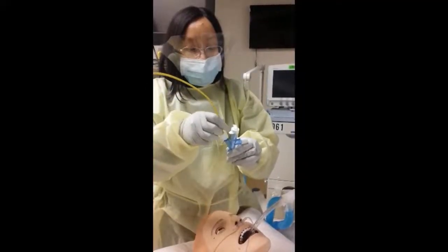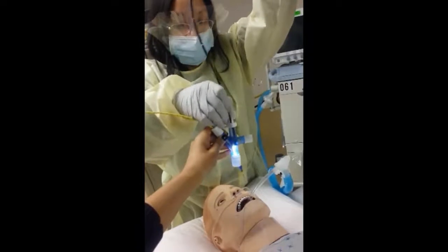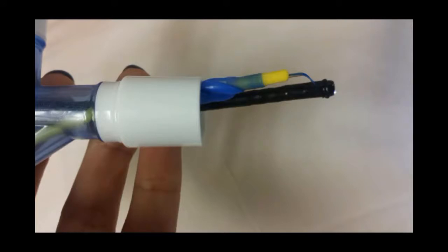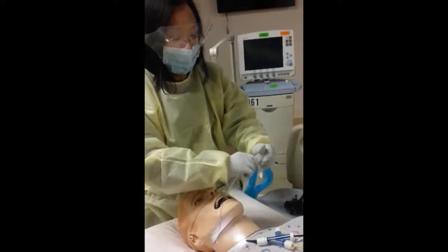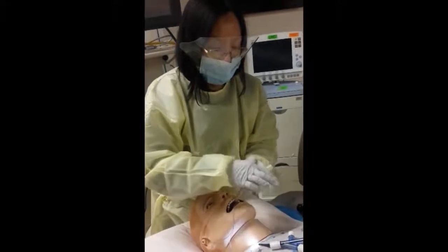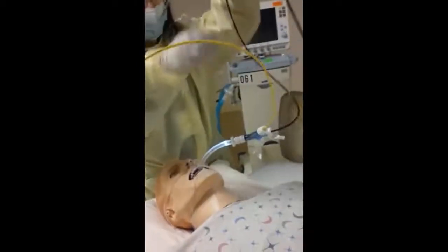First, insert the endobronchial blocker into the adapter. Then insert the bronchoscope. Then you will manually loop the snare around the end of the scope and tighten by pulling the proximal end of the snare loop. This is how they should ultimately appear. Then, disconnect the ventilator and attach the adapter with the scope and blocker to the endotracheal tube. Reattach the ventilator to the remaining port of the adapter, which is not shown in the demonstration.